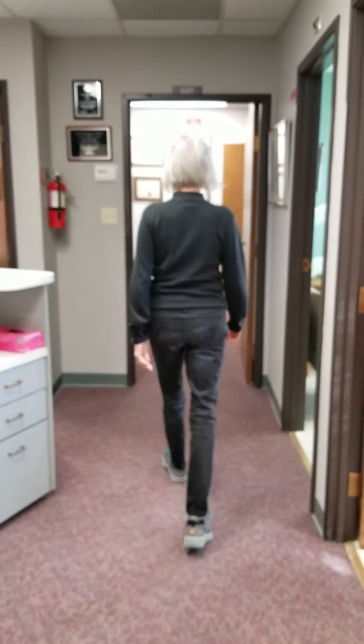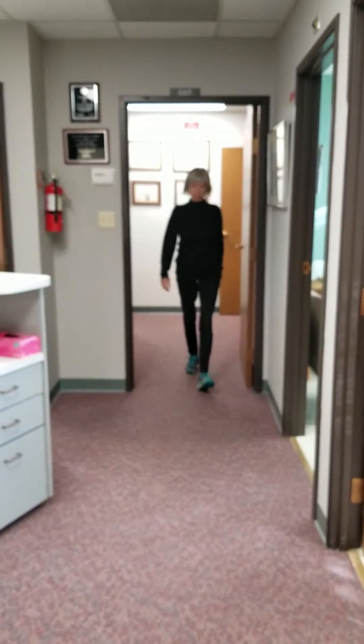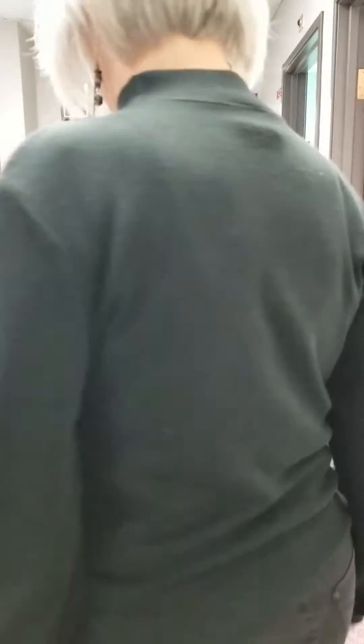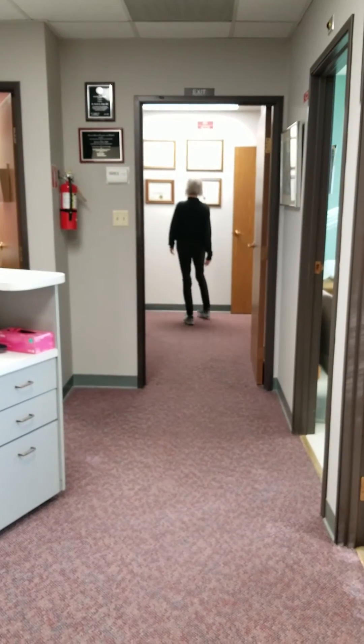Here we go with the lift added in. You can see her head is not bobbing from side to side — she walks much more smoothly now, and is very pleased with the feeling that she can take longer strides and is much more comfortable.